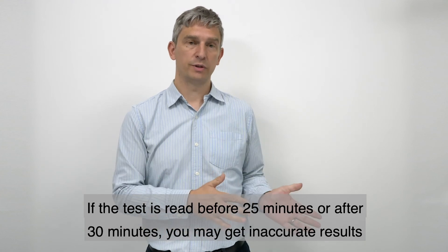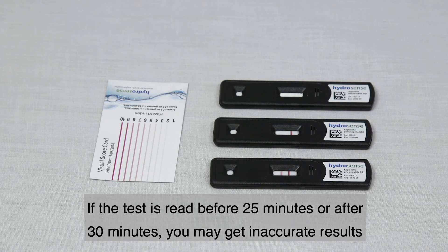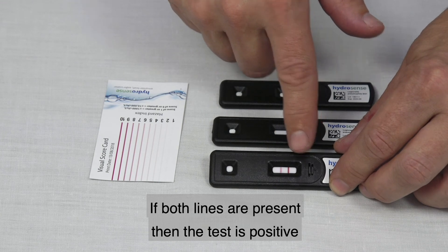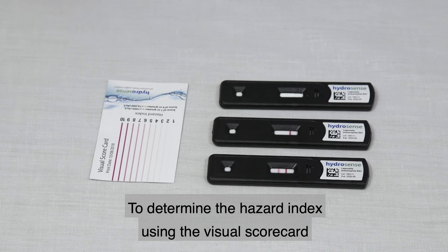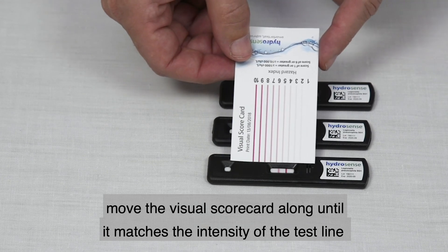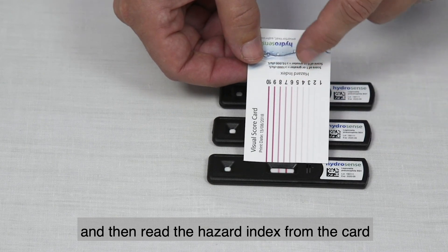If the test is read before 25 minutes or after 30 minutes, you may get inaccurate results. The test consists of two lines: a test line and a control line. If both lines are present, the test is positive. To determine the hazard index, use the visual score card — move it along until it matches the intensity of the test line, then read the hazard index from the card.